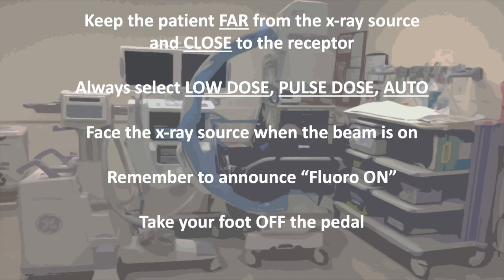Most importantly, minimizing the time your foot stays on the pedal is the biggest way to reduce radiation exposure for both your patient and yourself.